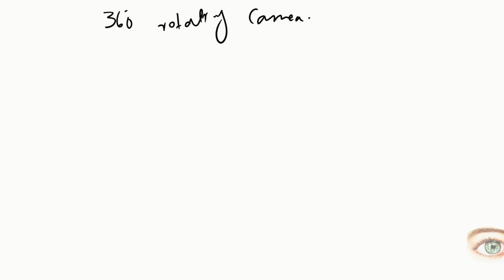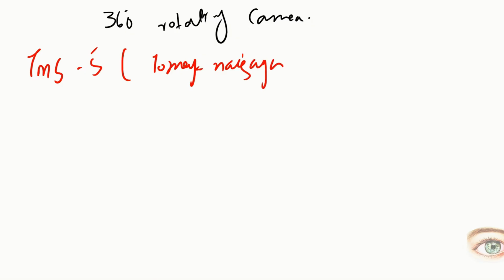Now, based on the Scheimpflug technology, four devices of different brands are introduced in the market. Those are TMS-5, which is Tomey, Nagoya, and as the name suggests, it's from Japan, right?